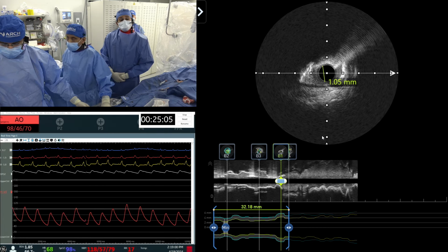Good. Okay. I like the idea of the atherectomy. I would probably use a 1.5 burr, with the idea that once you get that, you can take shockwave down if you can follow up with it. That diagonal is super big. Traditional is probably not a good idea there with the calcium. If you lose it, you'd have a lot of trouble. So I think atherectomy is good. The only thing I'd do is probably start with a smaller burr where you got stuck down at the bifurcation, and the more proximal stuff you could treat with shockwave. And then obviously look at the diagonal after you've done your initial atherectomy.